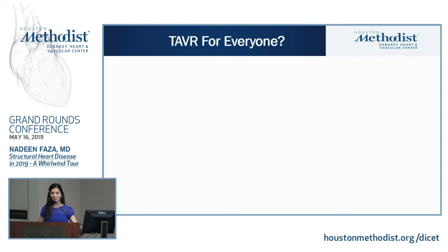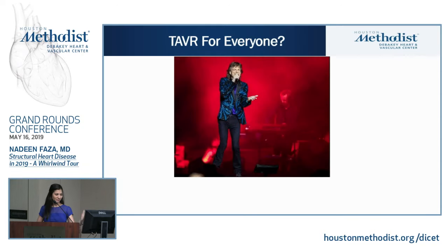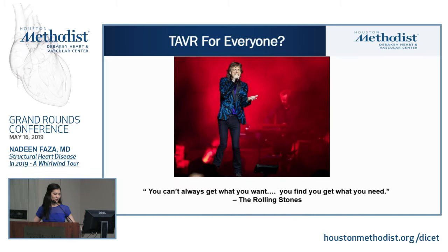The question is now, TAVR sounds very attractive, and it's easy to explain to the patient that they're only going to end up with a small puncture site in their groins, speedy recovery, but is TAVR for everyone? And this is Mick Jagger again, recently had his TAVR, and it reminds me of one of the lyrics for the Rolling Stones songs. You can't always get what you want, but you find you get what you need.